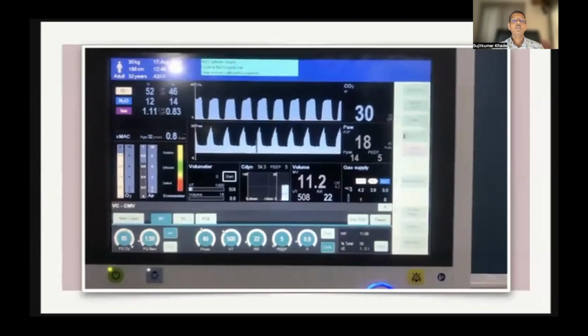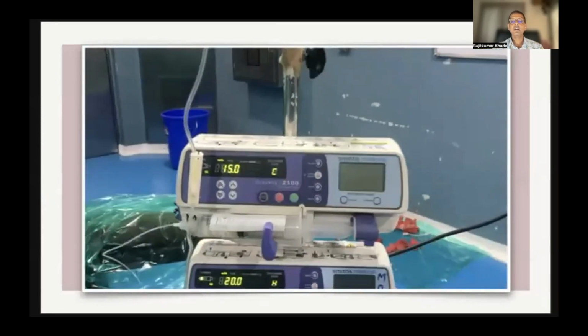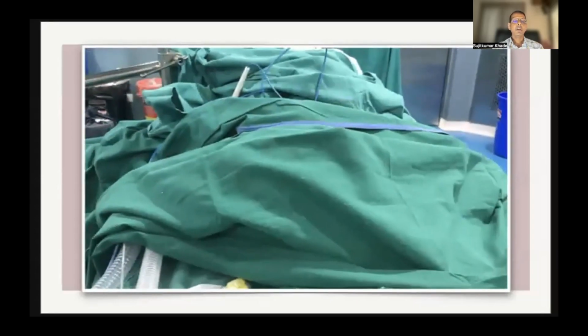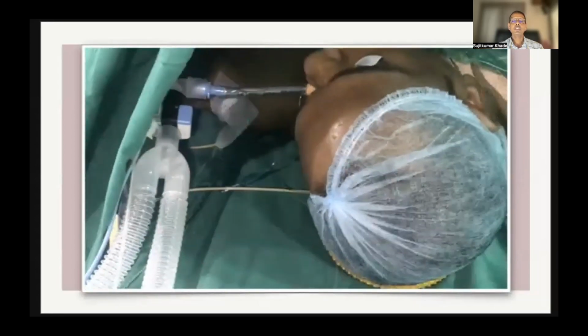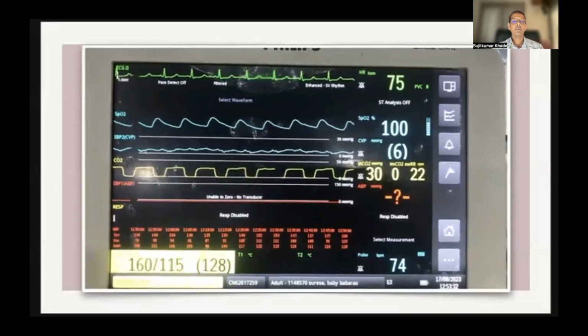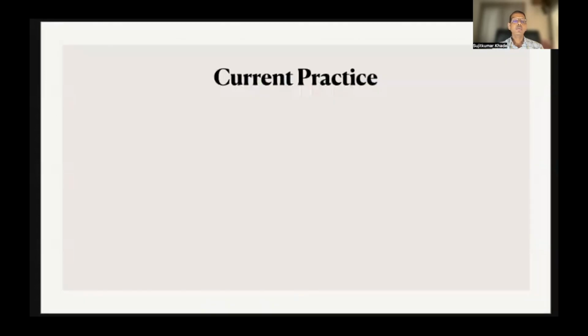This shows how the anesthesiologist's attention is grabbed by various screens like the anesthesia workstation, multi-para monitor, and syringe pumps. And this is not all. The anesthesiologist has to have situation awareness. He needs to see the surgical field for blood loss, watch for urine output, and various biochemical parameters like ABG, blood sugar, and electrolytes. Currently, what we do as an anesthesiologist, we collect data like hemodynamic, ventilation data, biochemistry, then temperature.